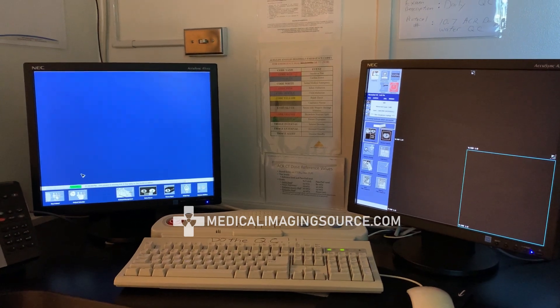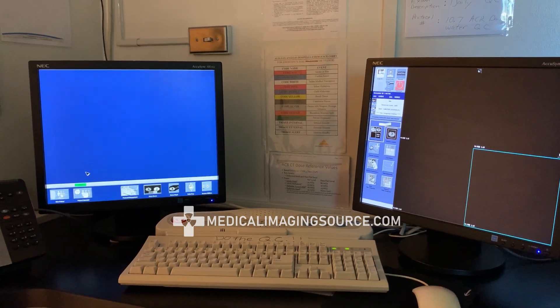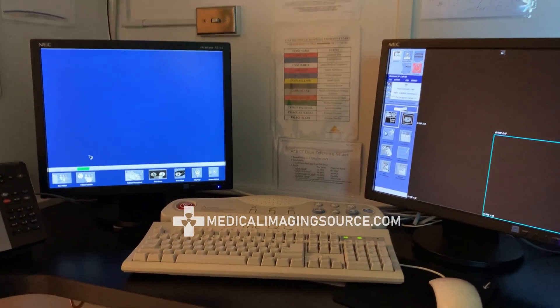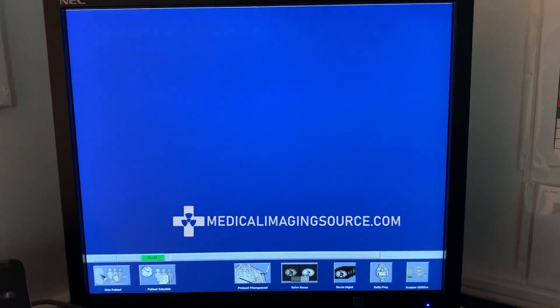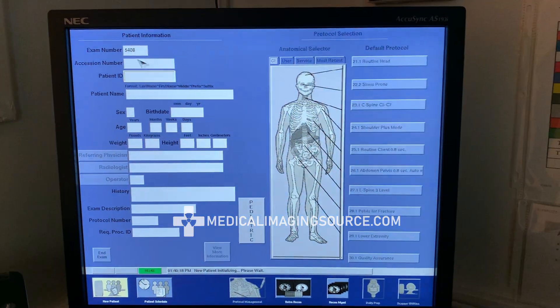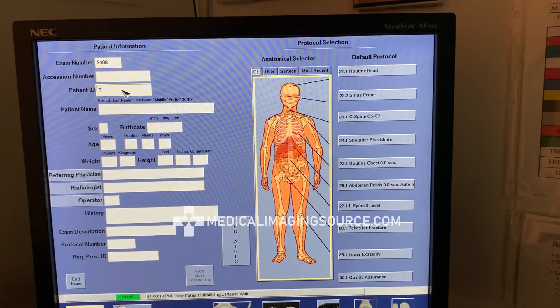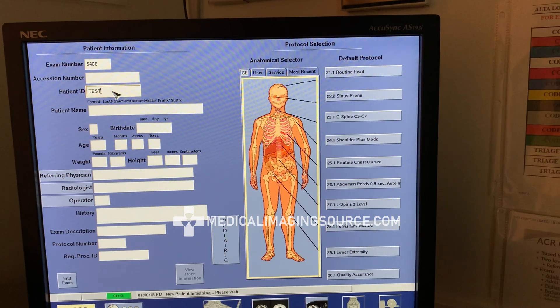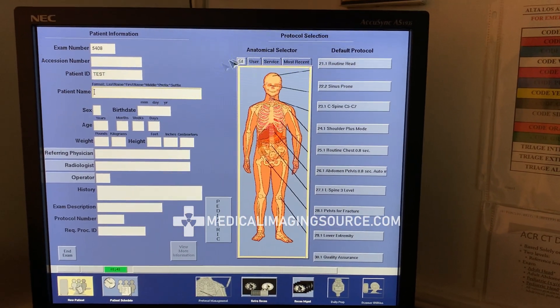How to perform a QA test scan for a GE LightSpeed 16-slice. First thing we're going to do is click on New Patient, and our patient ID is going to be 'test'. Click on Enter.